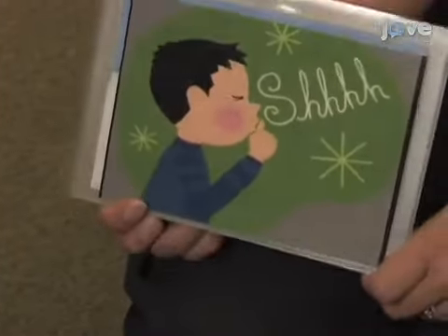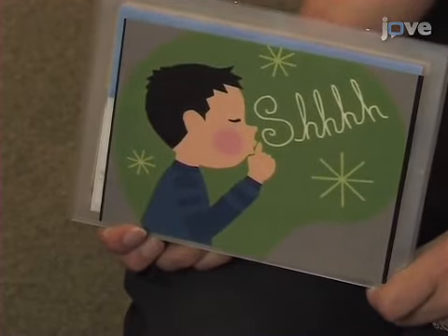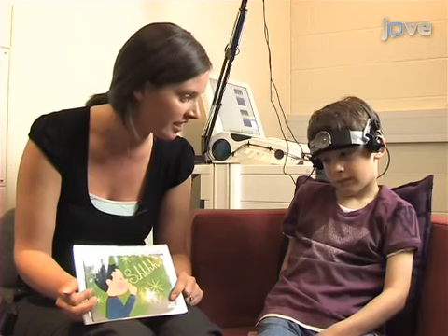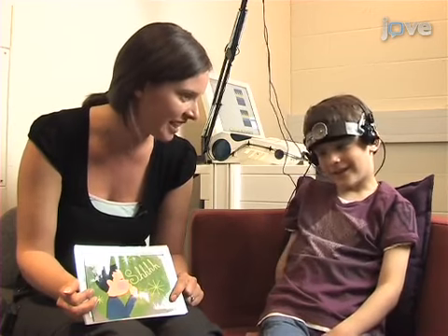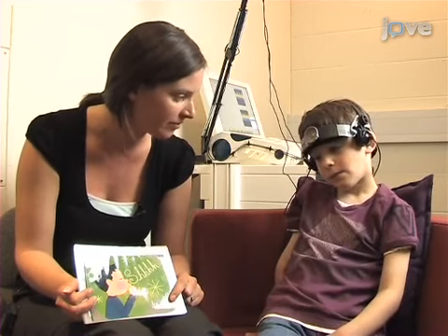And then when you finish telling me what's happened in the video, you're going to see a picture of a boy going shh. And when you see that, I want you to be really quiet and still and stop talking and not tell me any more, okay? And just wait a little bit and then the video will come back on.